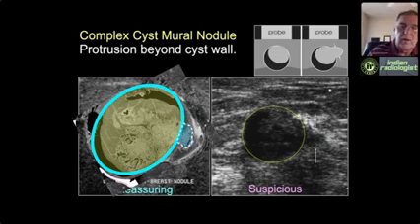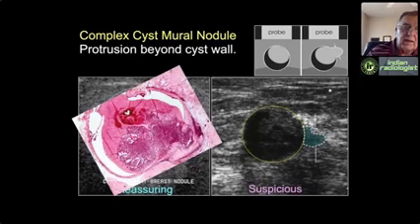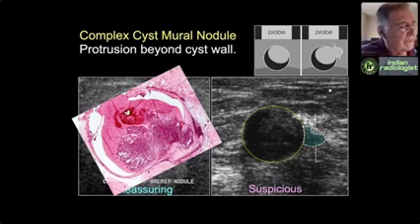Why? Well, let's take away all these lines and bring pathology back. All along the internal surface that's surrounded by fluid, benign and malignant lesions have exactly the same shape and surface characteristics. Why is that? What determines shape and surface characteristics? Two things.